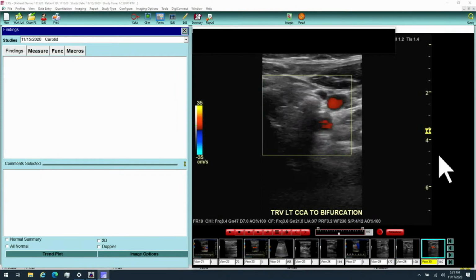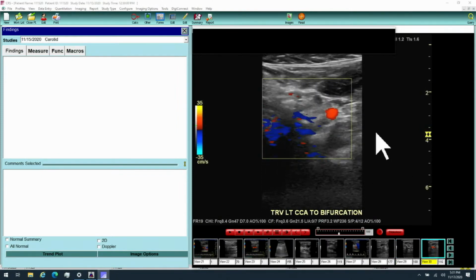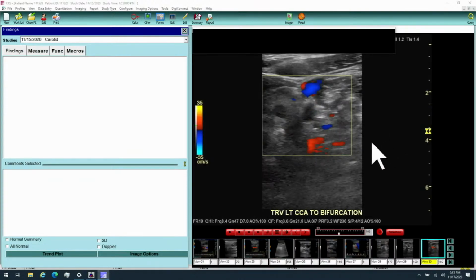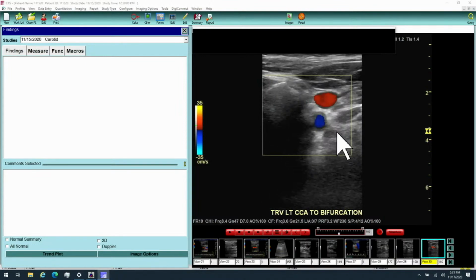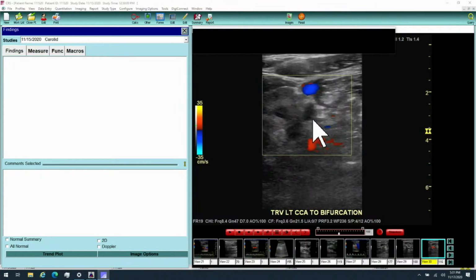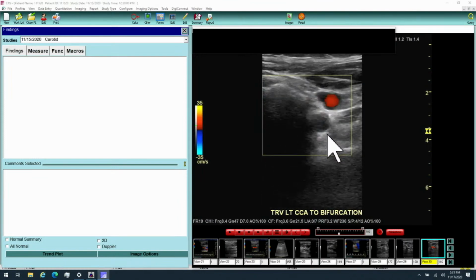The cysts in the thyroid. Yeah, not really seeing it. Those are just incidental findings. Right. We do not focus on that much. I saw it, yeah, I see what you're saying. It's like a parathyroid maybe. So definitely having a hard time seeing the bifurcation.